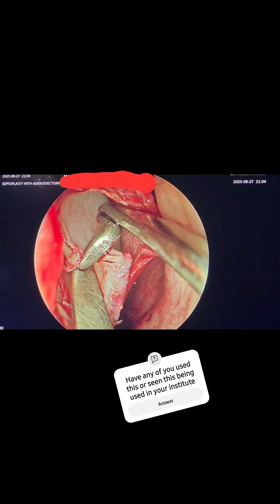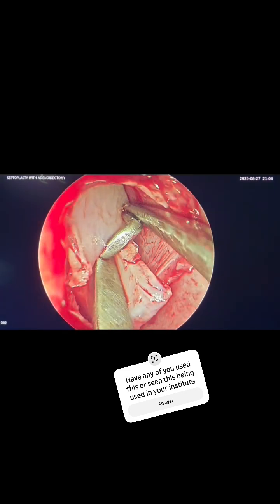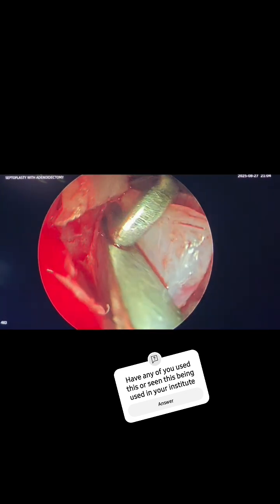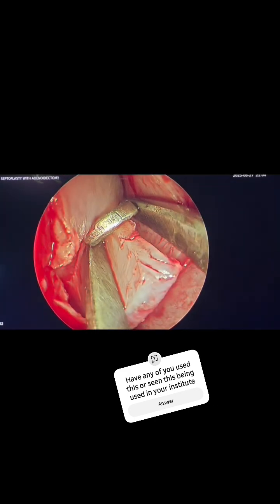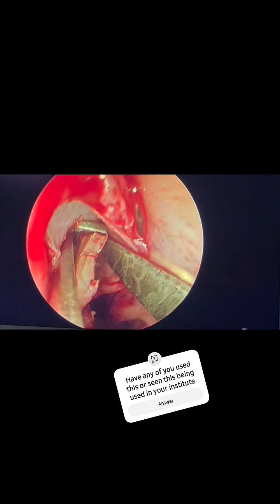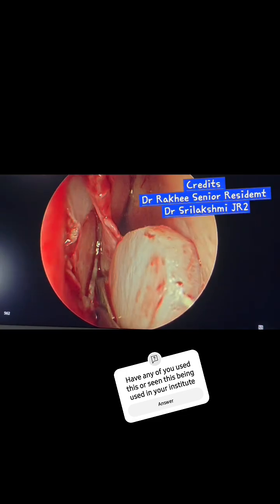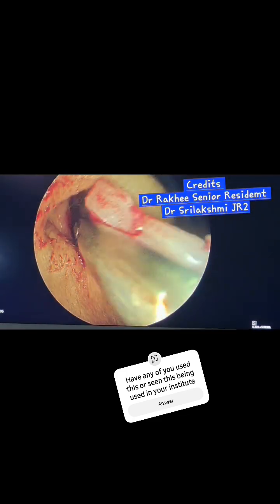We keep pushing it posteriorly as much as we want, and we should ensure that the flap does not get torn. The advantage is that the guards are protecting the flap as we cut. Once we want to round off and sufficient cartilage has been removed, we bend it down and the cartilage can be removed. This is how we use a Bellinger swivel knife.